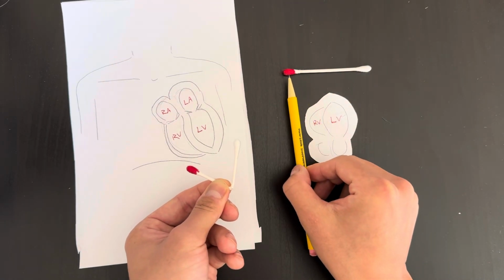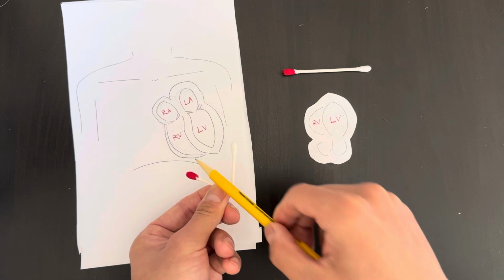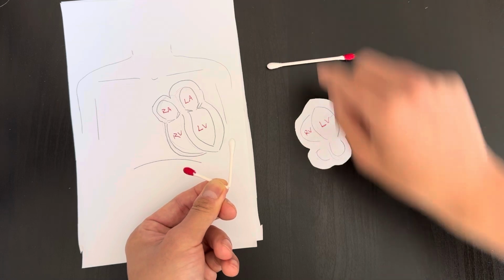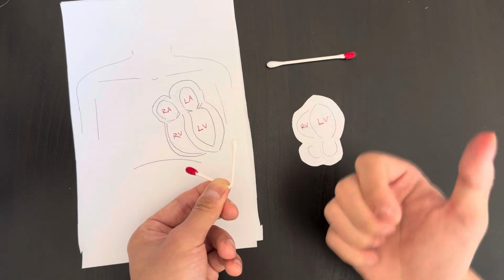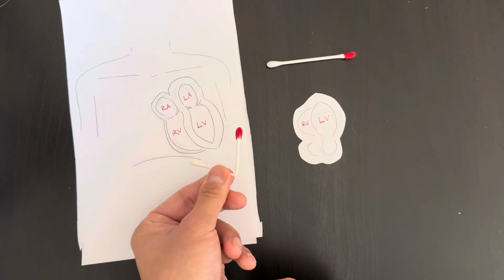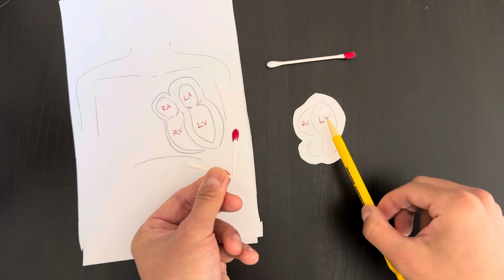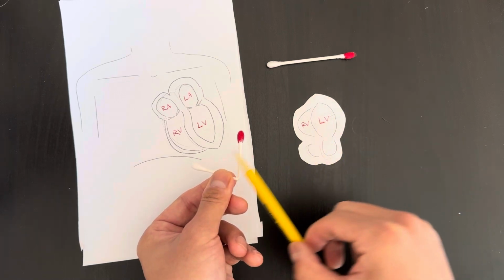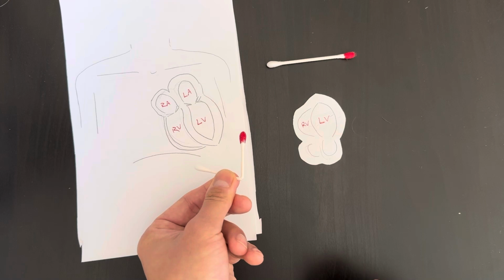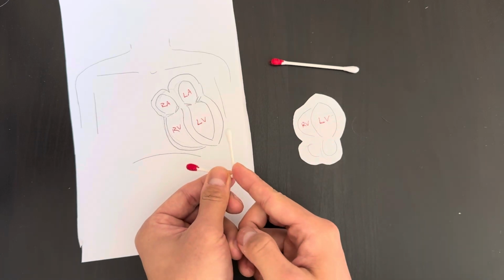As in, probe marker to my left, probe marker is still to my left, points towards the RV, and it points towards the RV here, right? And if you were on cardiology mode, where now you're pointing towards my right, or the LV, I would just flip it here. So now I'm scanning from below, probe marker on the right of the screen, on my right, pointing towards the left of the patient, or the LV, okay? So cardiology mode, apical 4-chamber, traditional radiology mode, 4-chamber.